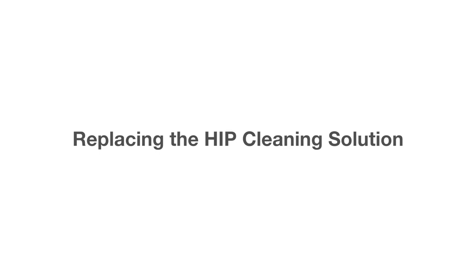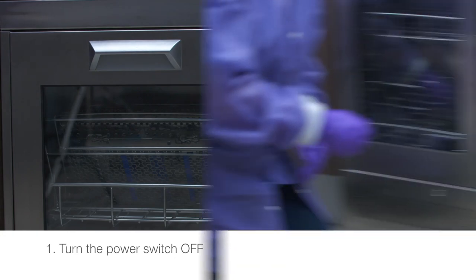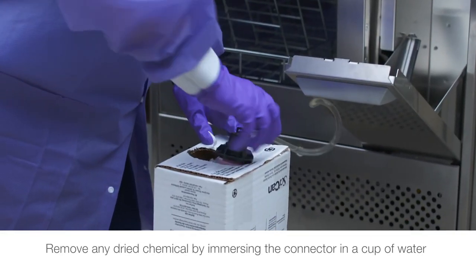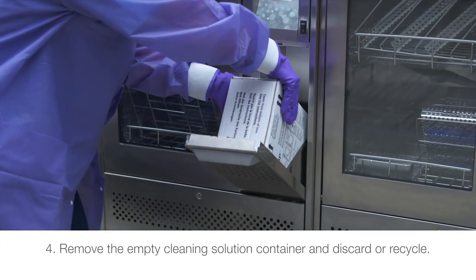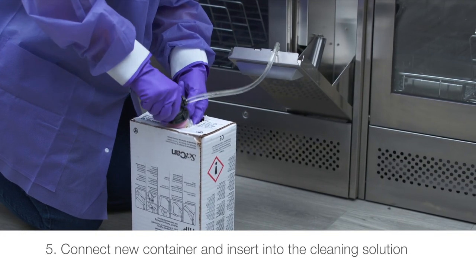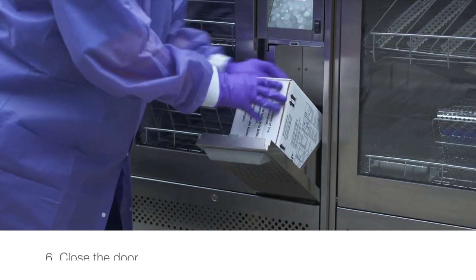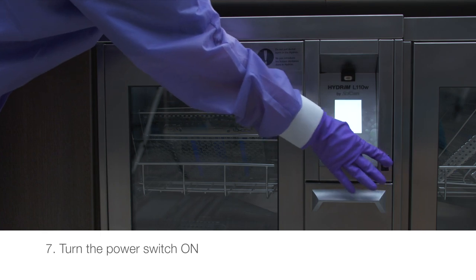To replace the HIP cleaning solution: turn the power switch off, open the cleaning solution door, disconnect the cleaning solution connector, and remove any dried chemical by immersing the connector in a cup of water. Remove the empty cleaning solution container and discard or recycle it. Connect the new container and insert it into the cleaning solution compartment. Follow the instructions printed on each cleaning solution container, then close the door and turn the power switch on.